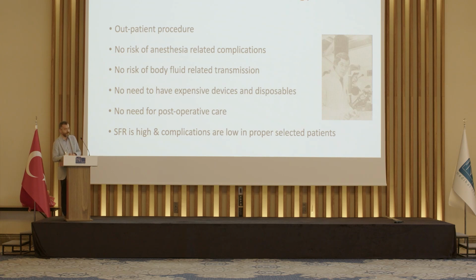There is no anesthesia for those patients. There is no body fluid-related transmission of some infections. There is no need to have expensive devices and disposables. You don't need any postoperative care. You do not hospitalize the patients. The stone-free rates are high and complication rates are low. And in the end, most of us will just say, okay, I want this technology.